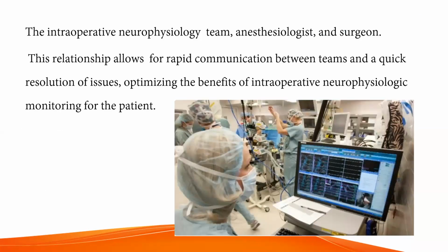Intraoperative neurophysiology is teamwork. It consists of a neurophysiology technician, an anesthesiologist and a surgeon. This relation allows rapid communication between the teams and quick resolution of issues, and optimizes the benefit of intraoperative neural monitoring to the patient.